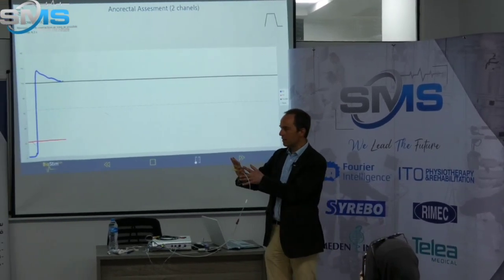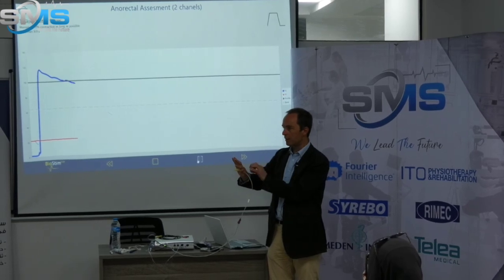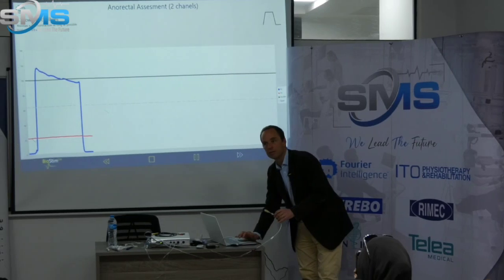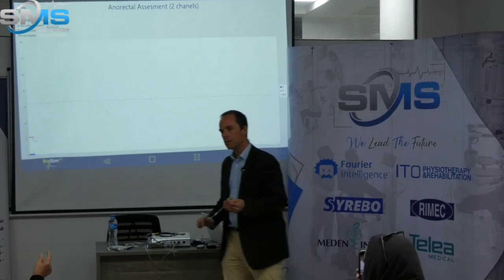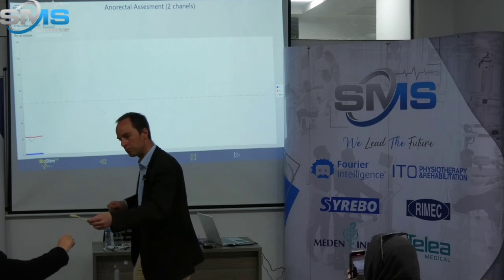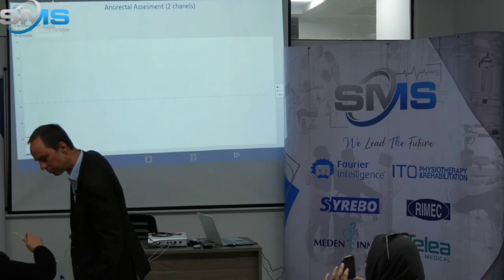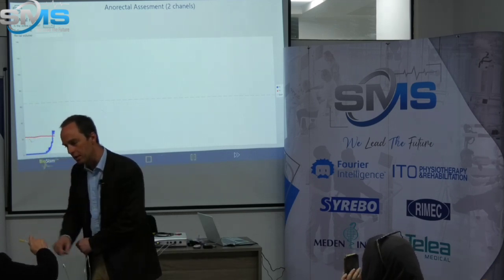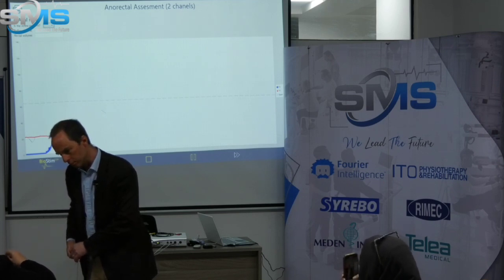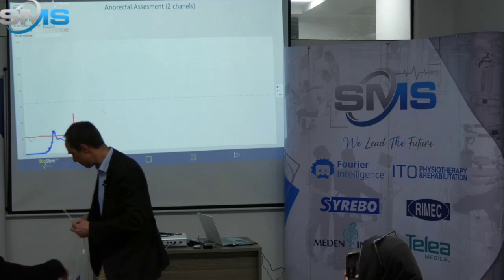Here we just test the efficiency of the sphincter, nothing else. And then the inner muscles, so the external sphincter. Yes, the external sphincter. And this one is inside the rectum. Inside the rectum, there is the parasympathetic, so it just feels the pressure. Yes, exactly.